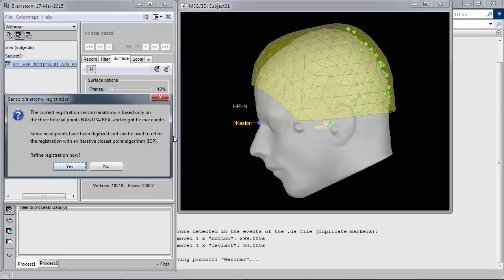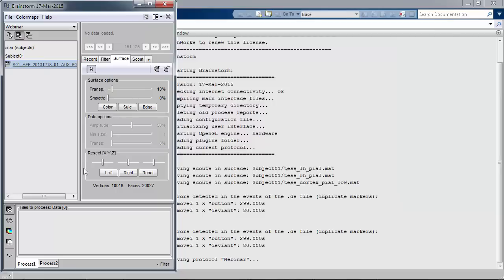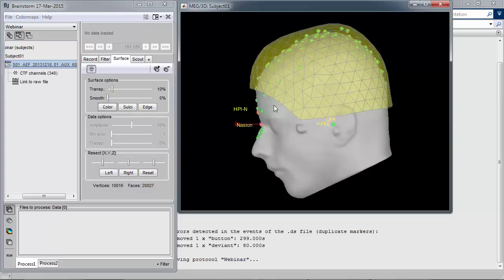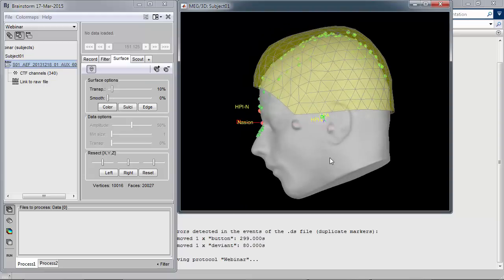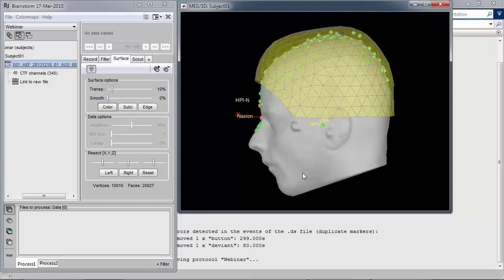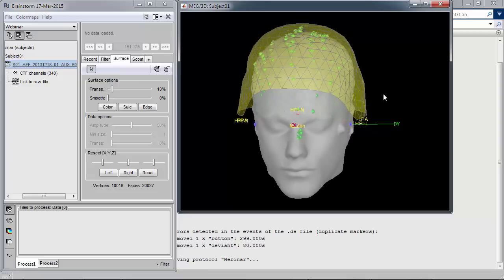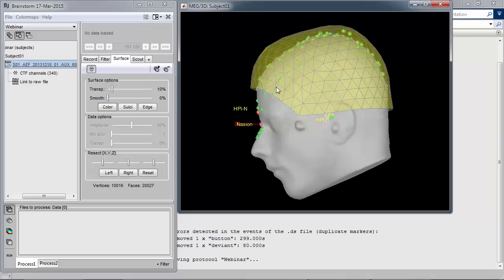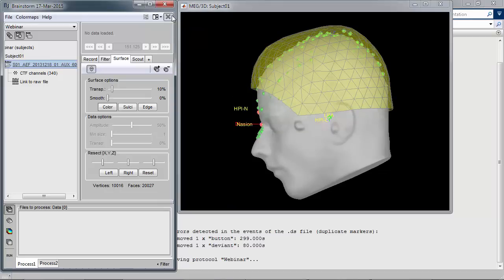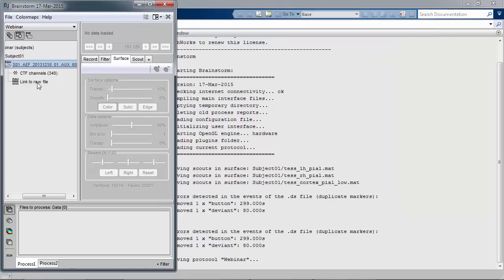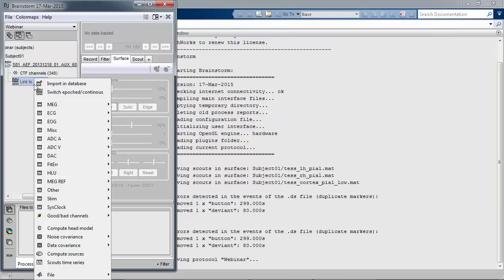This is a rendering of basically the helmet, and I'm going to adjust the position of the head in the helmet to make sure the registration is close to perfect with MRI. The yellow surface is a rendering of the inner surface of the MEG helmet where the sensors are located. The green points are scale points digitized at the moment of data collection, which help improve the registration. Let's clean that up and go directly to the data.